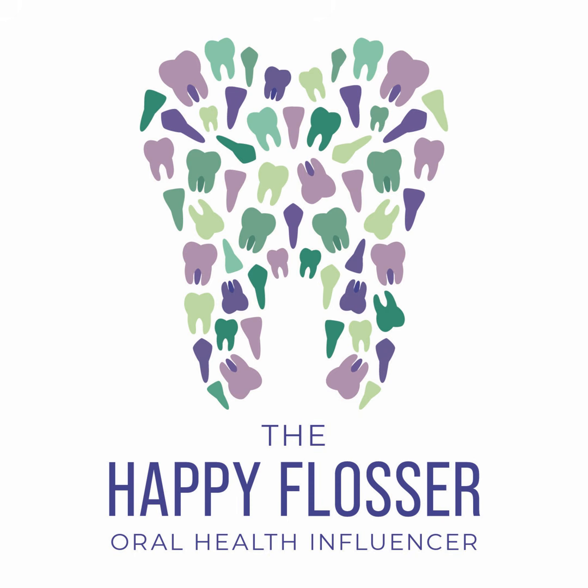But most patients I've discovered have a gag reflex that settles down if you start with the anterior teeth. You can use some distraction techniques to help your patient overcome that gagging reflex. Sometimes we have them lift their leg, or sometimes we'll have them breathe through their nose. Providing those positive statements, starting with the anterior teeth, goes a long way at calming down the gag reflex. We know that those maxillary posterior images cause the greatest amount of reflex, and so we want to take those images a little later in the process.